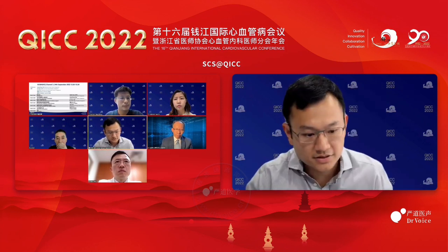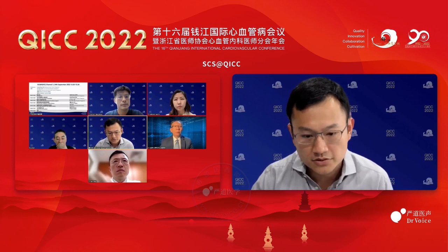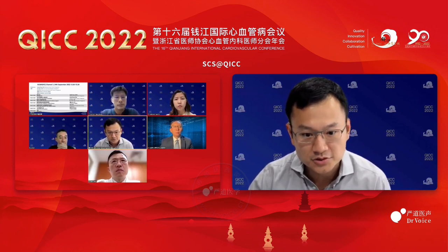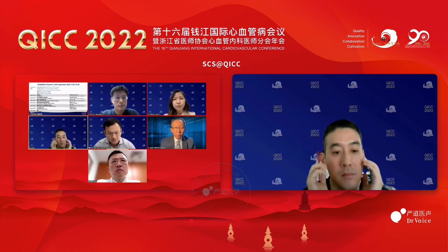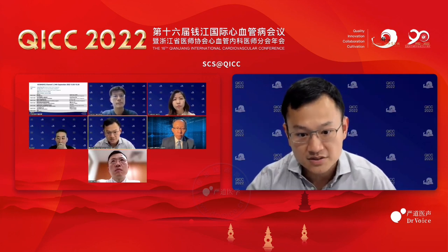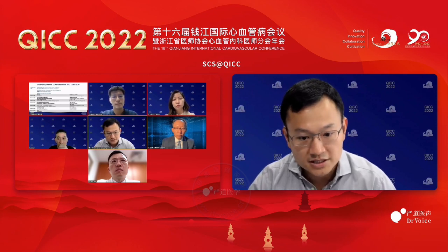Okay, thanks for that response, Jiang Ming. I'll just add on a very short point about the use of OCT in the left main. Sometimes we are told that OCT may not be so suitable for use in left main because we need to engage the left main properly for contrast clearance, and sometimes that means that we might miss a very proximal or ostial left main lesion.